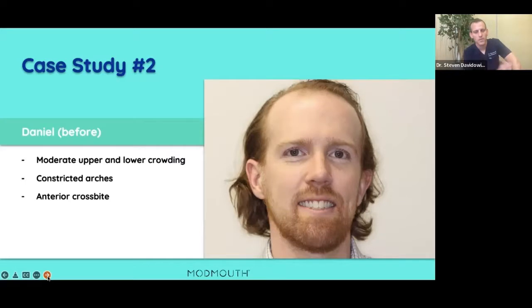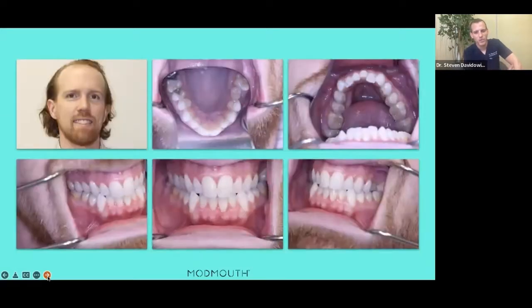We always take our photos. Take your photos. It's so worth it because then you have them. Once you have the photo, you can just submit it for a clear aligner case. If not, you have to have the patient come back. So you already have them. They don't have to come back. When they come back, they're starting treatment. So these are the photos we took on that same day.